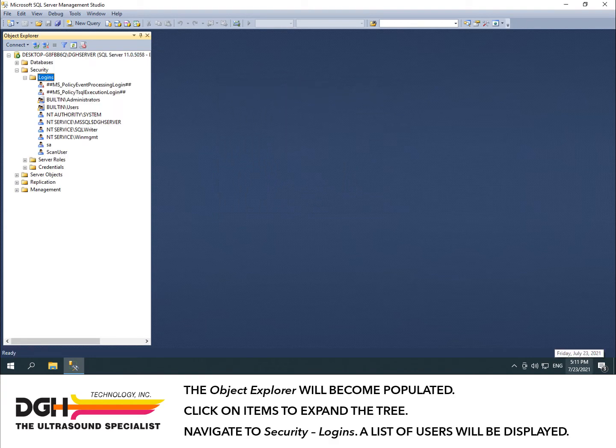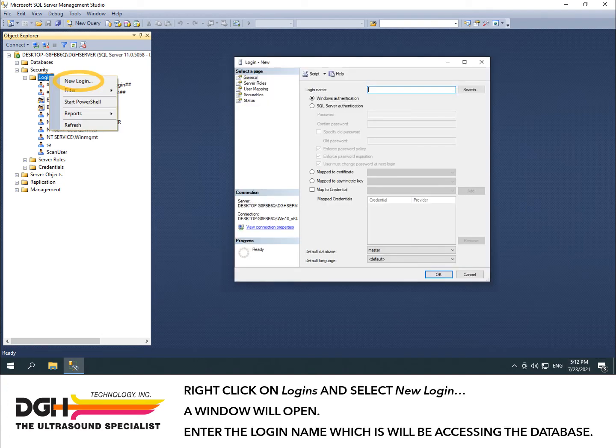The Object Explorer will become populated. Click on items to expand the tree. Navigate to Security Logins. A list of users will be displayed. Right-click on Logins and select New Login. A window will open. Enter the login name which will be accessing the database.